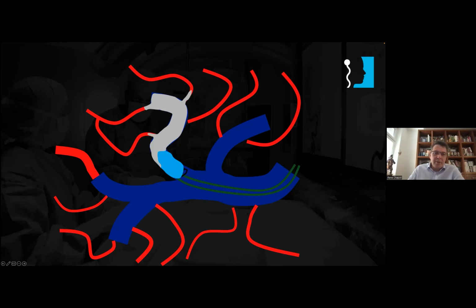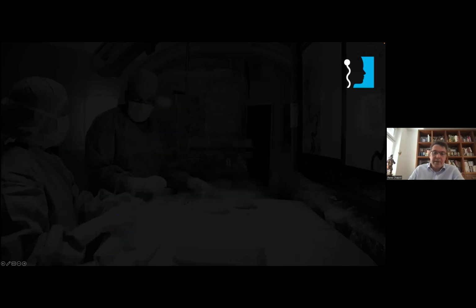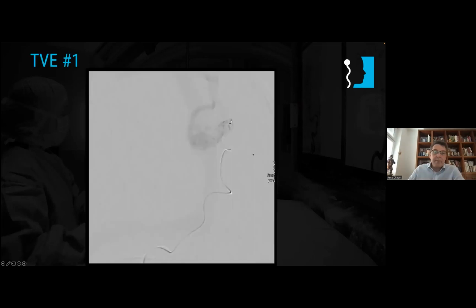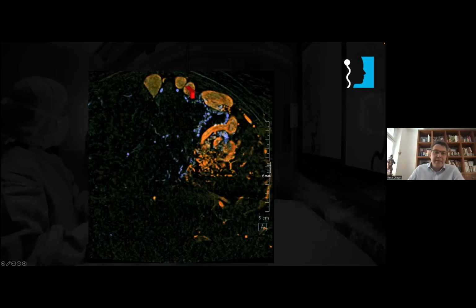And if you treat one compartment by the vein, then you can do it a second time, a third time, and a fourth time to cure this AVM. And this is what we did here in this young patient, where you may look at the MPRs, and when looking at the MPRs, you may see here that this is a primary vein joining the main vein.